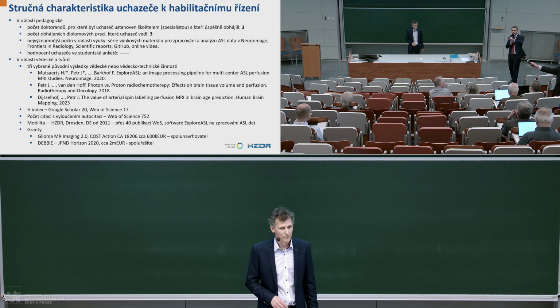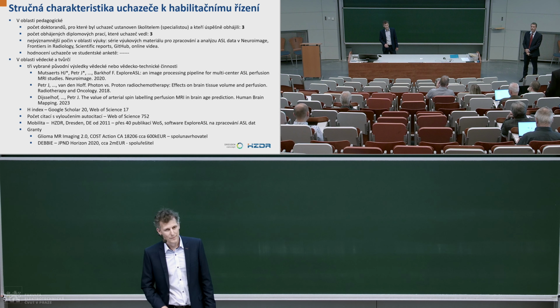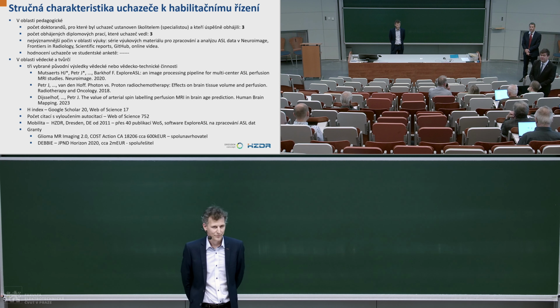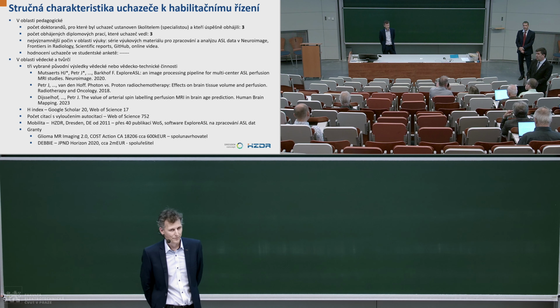Professor Tintera: I just wanted to explain a bit how this works. This is really in microtesla because we use the magnetic part of the radio frequency pulse, not the electric part, but the magnetic part. So you can express it in microtesla, but usually we specify the RF pulses by amplitude in, let's say, volts, and this is up to about 100 volts approximately. But it depends on which slice thickness it is, how big the subject is, and so on.